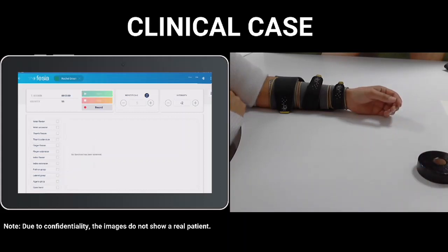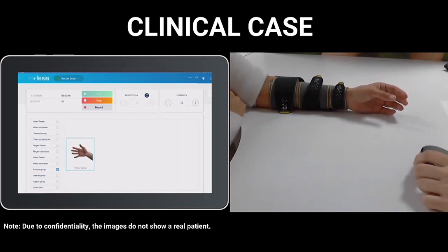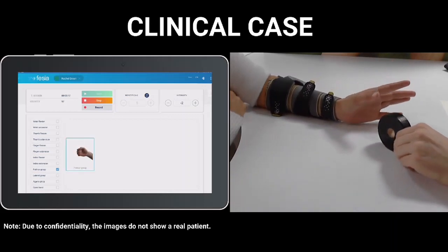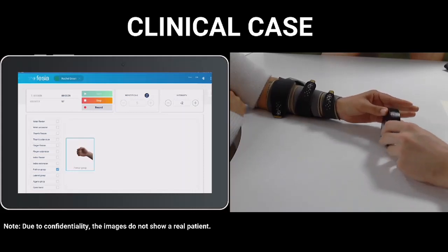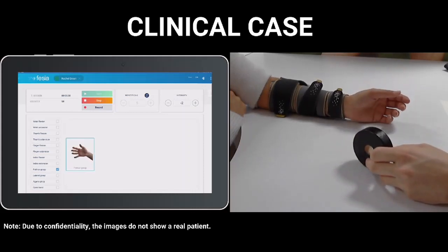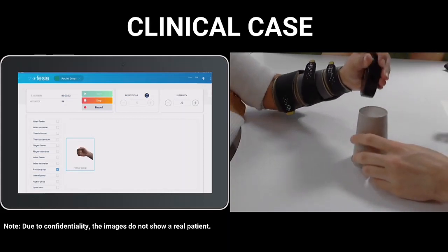I will select the palmar grasp here. And first of all, as before, just select all the movements so you know the times. Perfect. And once we know the timing, we can grasp this object and let go again. Perfect. We can grasp it again and you can put it here, for example.